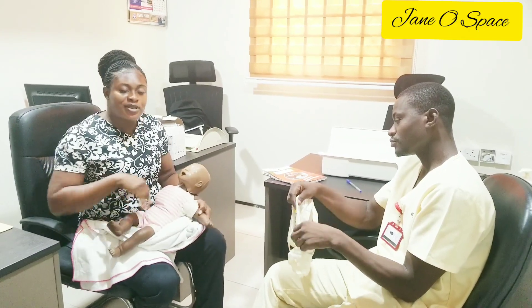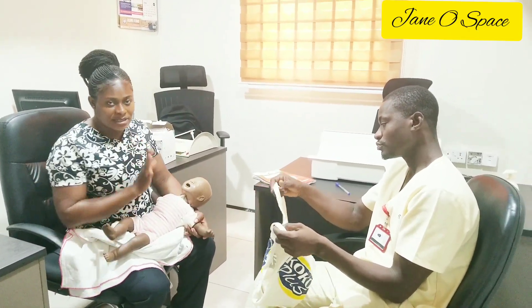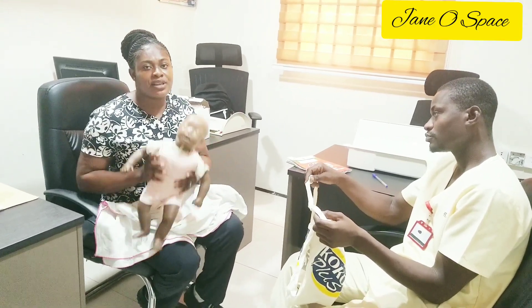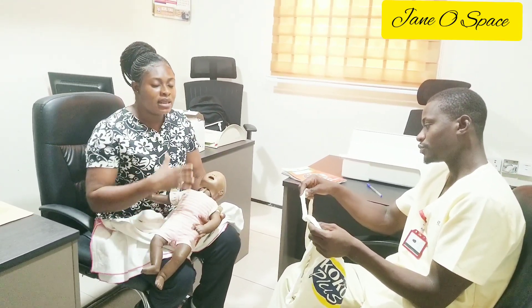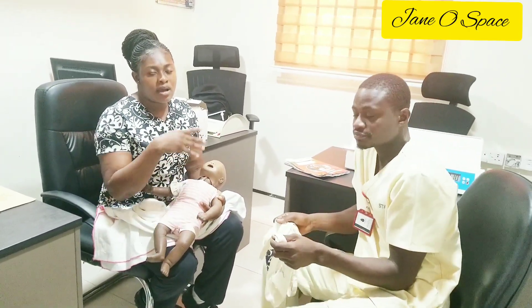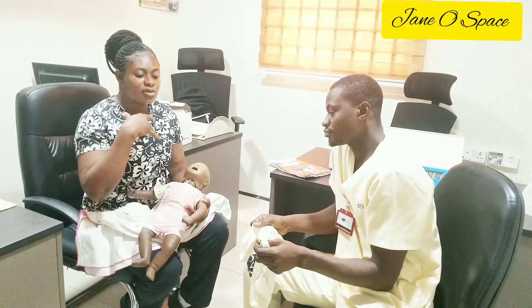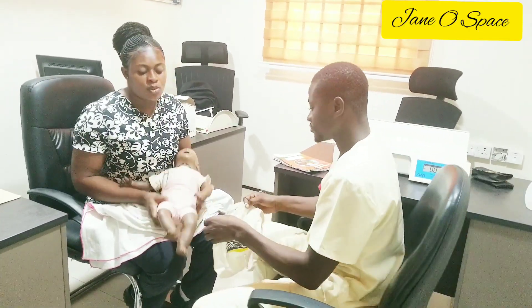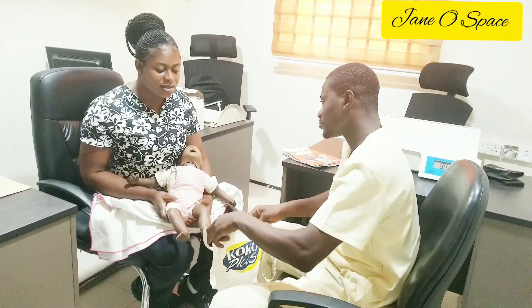It's the same process — you have to take off everything from the child. So we are assuming we've taken everything from the child. The nurse needs to assist the mother, so our helper here is going to assist me. We are going to put on the child's weighing pants.